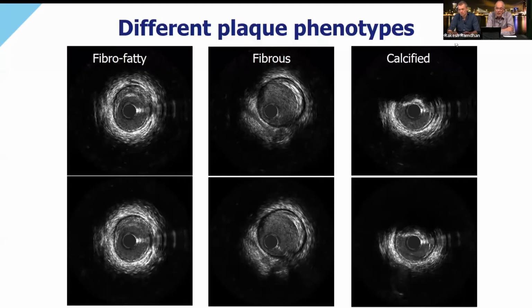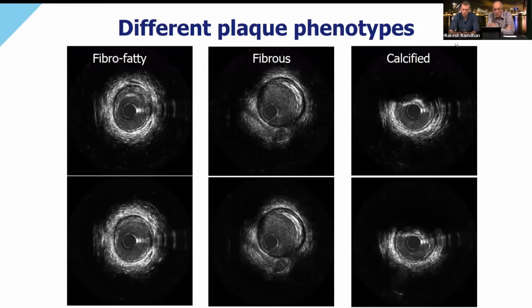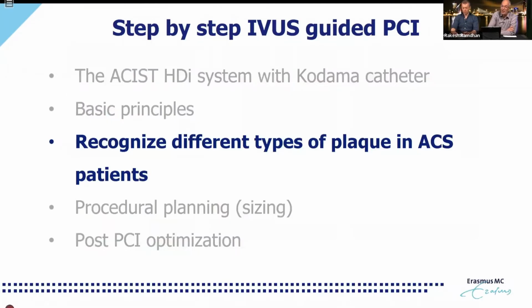That means that most of the ultrasound signal is reflected by the calcium. What goes through finds the calcium on its way back and will be reflected the other way around. So behind the calcium, we see no information behind the calcified plaque. As you can see, this calcium is also quite stiff. And as you all know already, that calcium means you have to do some lesion preparation.